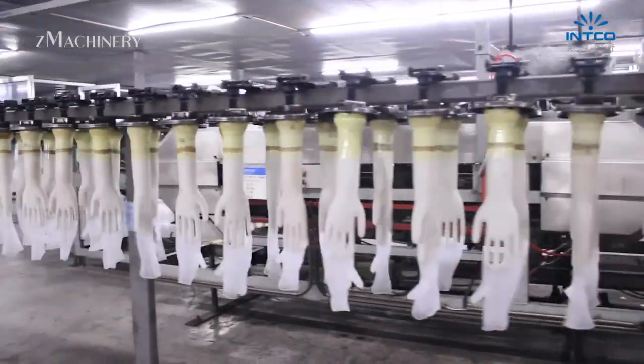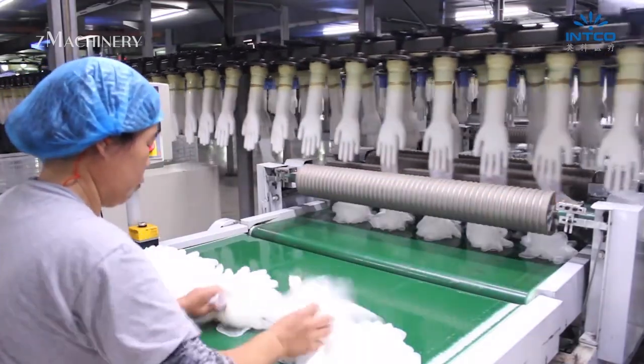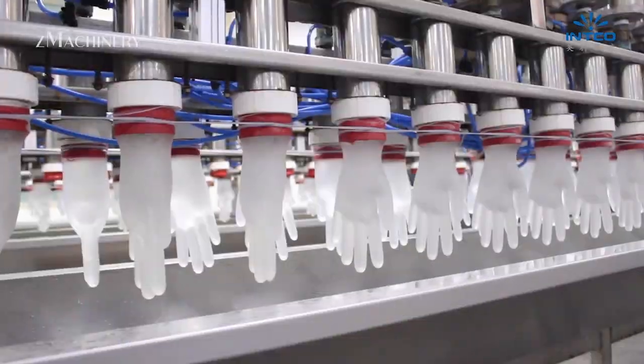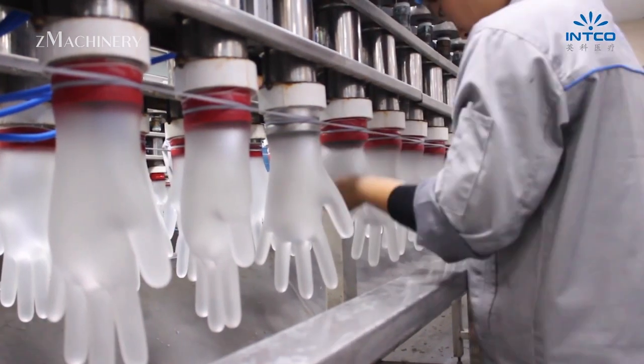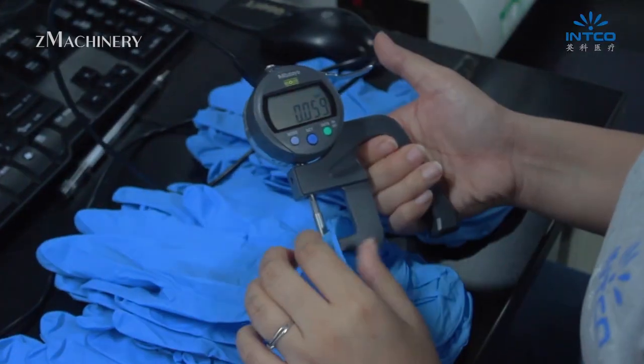This high-heat treatment enhances elasticity, strength, and durability. Once cured, gloves are removed from the formers by automated systems or manual methods. Each glove undergoes thorough inspection for punctures, thickness, tensile strength, and other quality parameters.